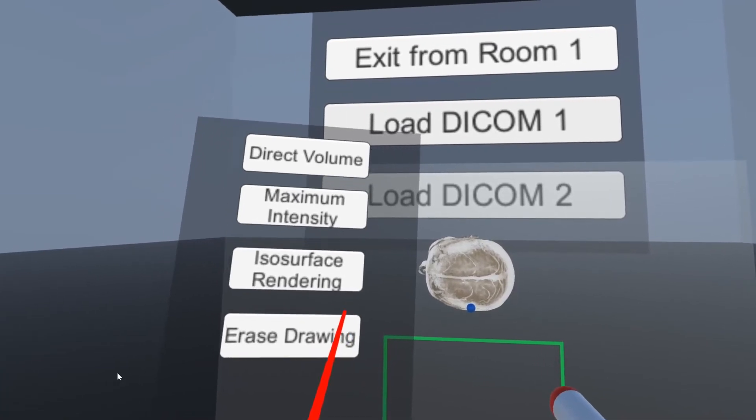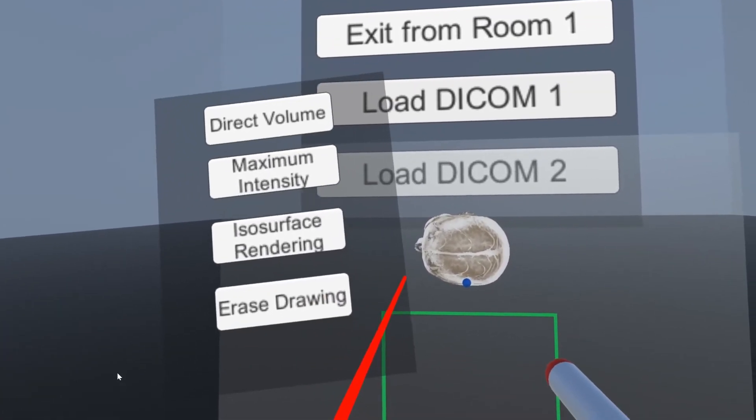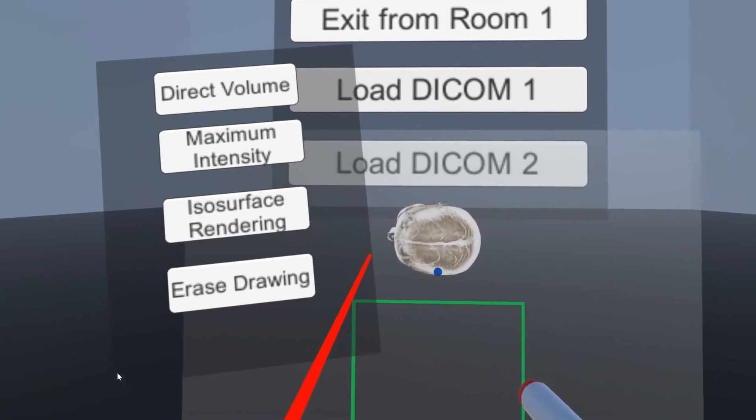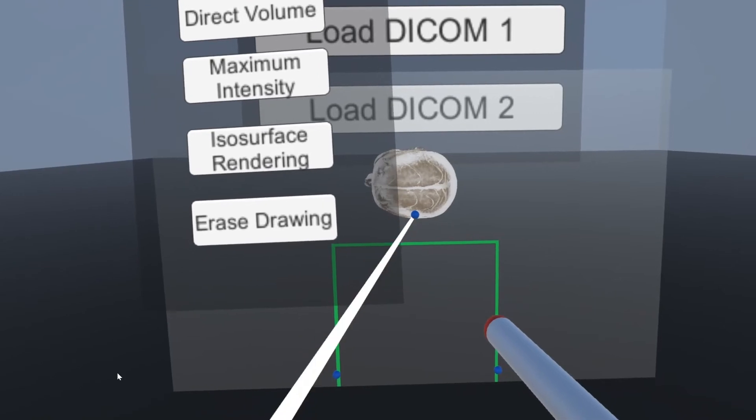After the medical scan has finished rendering, doctors are then able to have a couple of tools at their disposal.